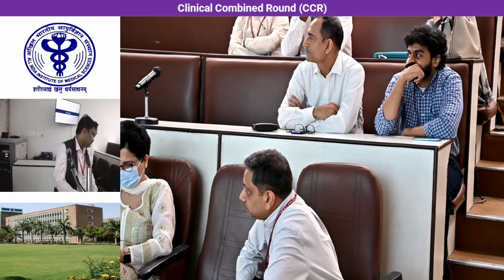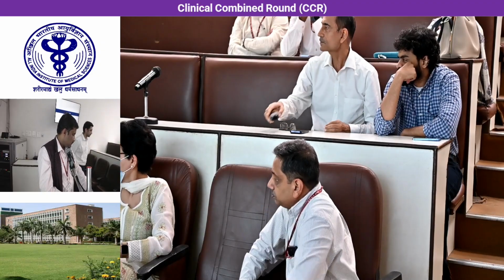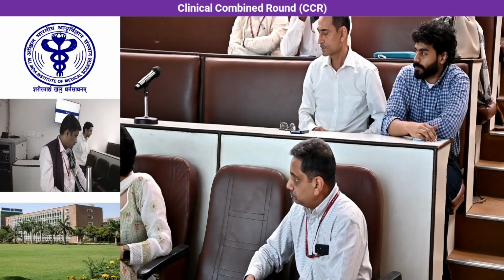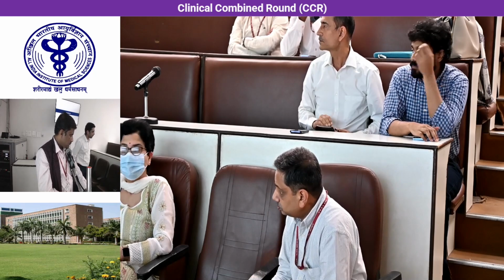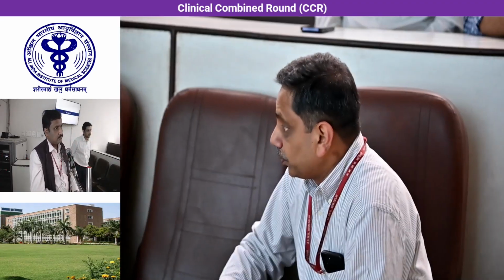Just in general, in terms of the robotic approach we are discussing on the topic, it's looking at less morbidity, but are they also going to see better oncological outcome? There is not much difference between open surgery. It's actually the perioperative patient recovery and morbidity, yes. Outcomes, nothing has shown to be better. No robotic surgery has shown better outcomes.